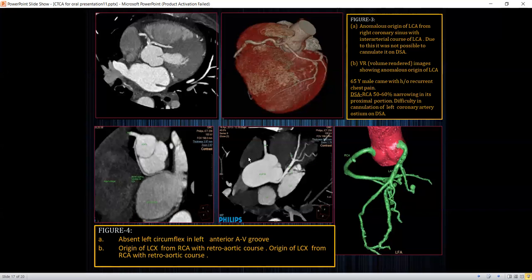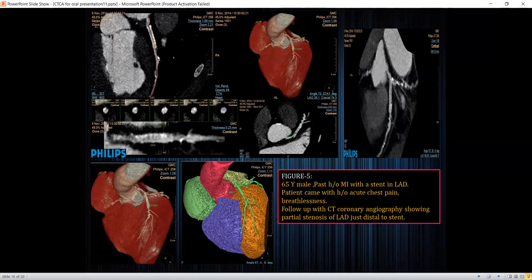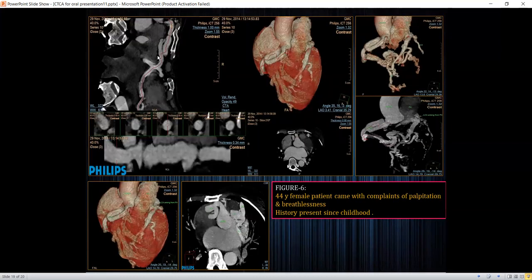In the fourth image, there is an anomalous origin of the left circumflex artery from the right coronary cusp. The fifth case is a 65-year-old male with a history of prior MI and stent in situ, who presented with acute chest pain in the emergency department; CT coronary angiography showed partial stenosis just distal to the stent. The sixth case is anomalous origin of the left coronary artery from the pulmonary artery, also known as ALCAPA syndrome.